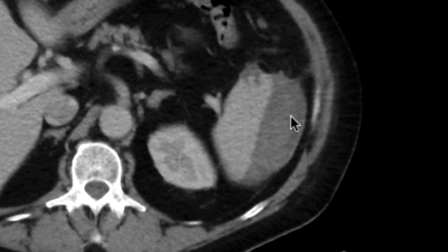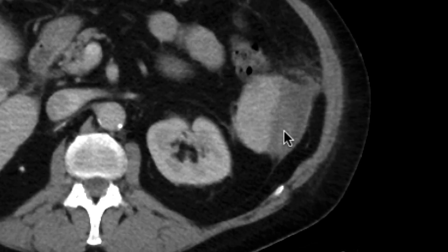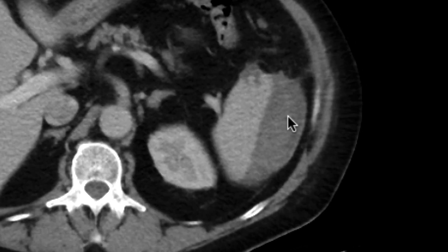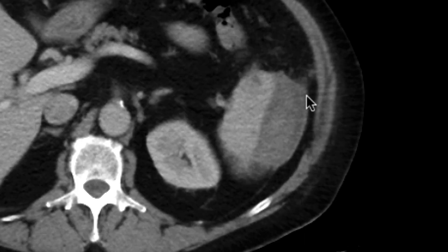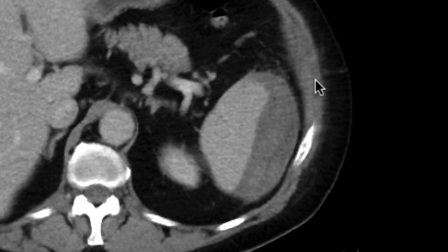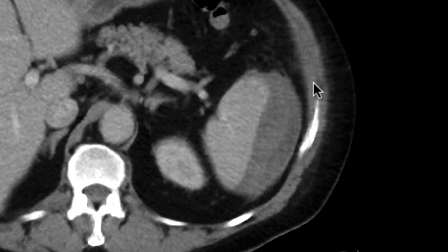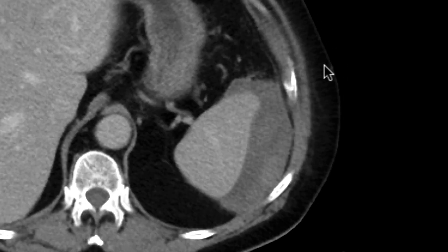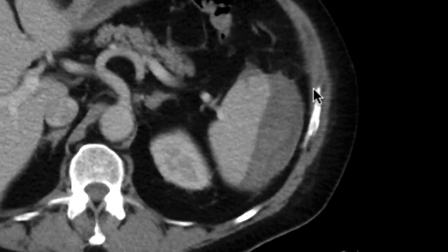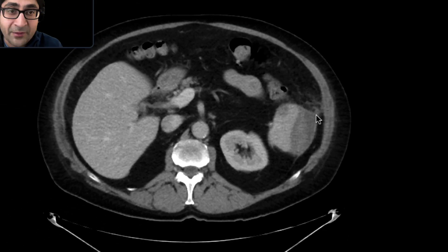As we look at the spleen even closer, we can notice that towards the inferior aspect of the spleen there's this ill-defined region of hypoattenuation — something that looks kind of linear. In the context of what's happening here, one really does worry about a splenic laceration with a hemoperitoneum or splenic hematoma associated with that.